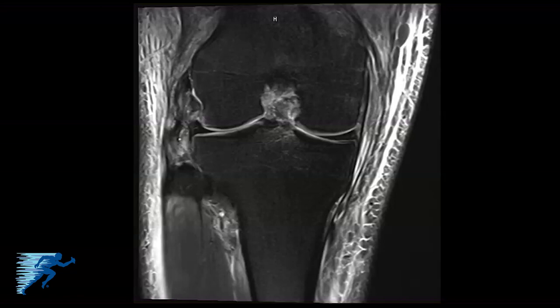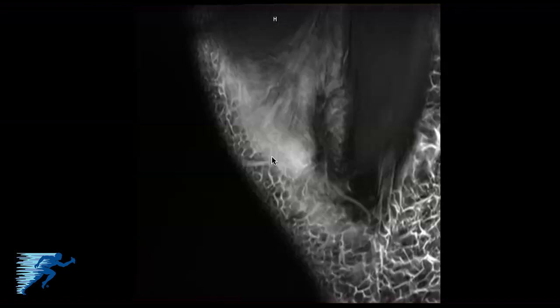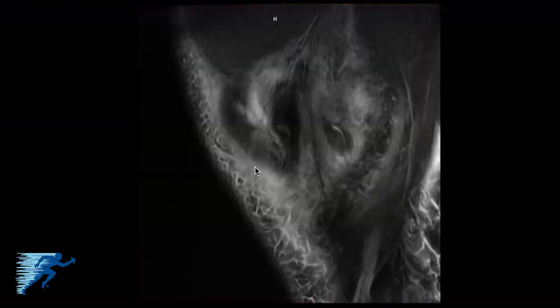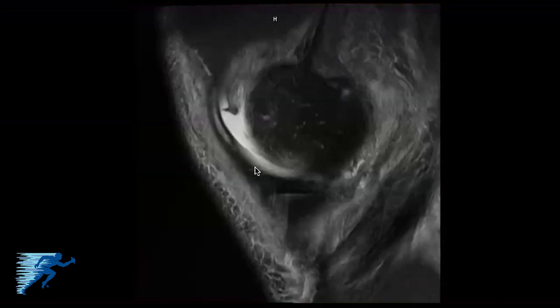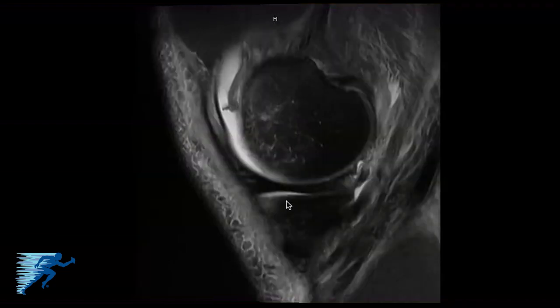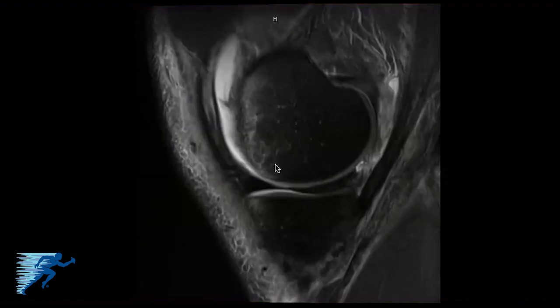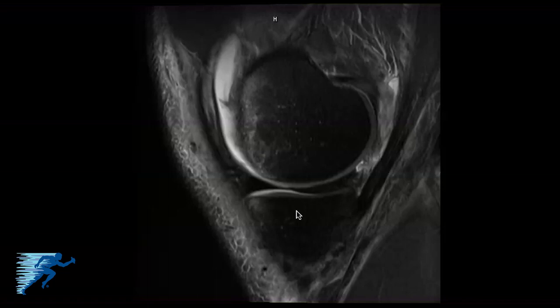The next image series is the sagittal images. Starting on the medial side of the knee and coursing over, we can see the bone bruise pattern on the anterior aspect of the medial femoral condyle and the anterior aspect of the medial tibial plateau, which is a common secondary sign of a posterolateral corner injury. Here is the direct arm of the semimembranosus on the medial side, and then the medial meniscus itself.